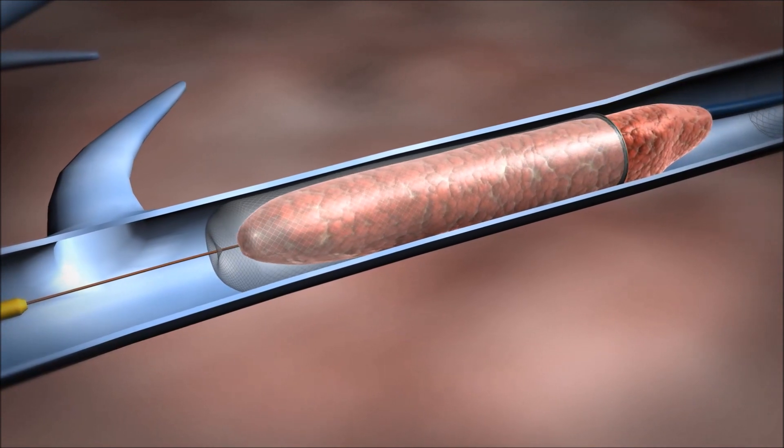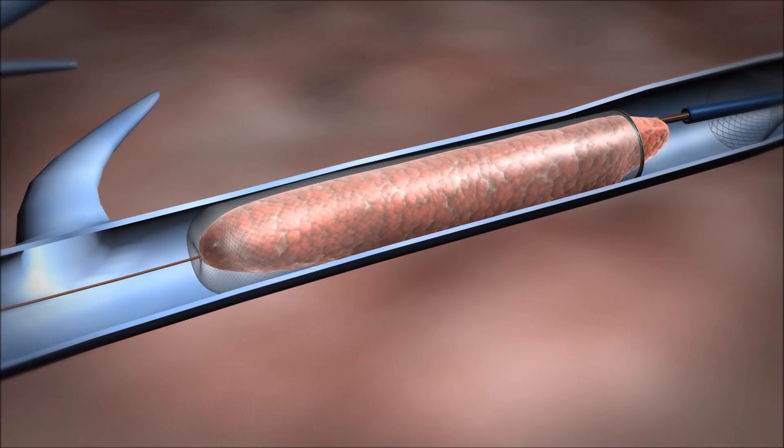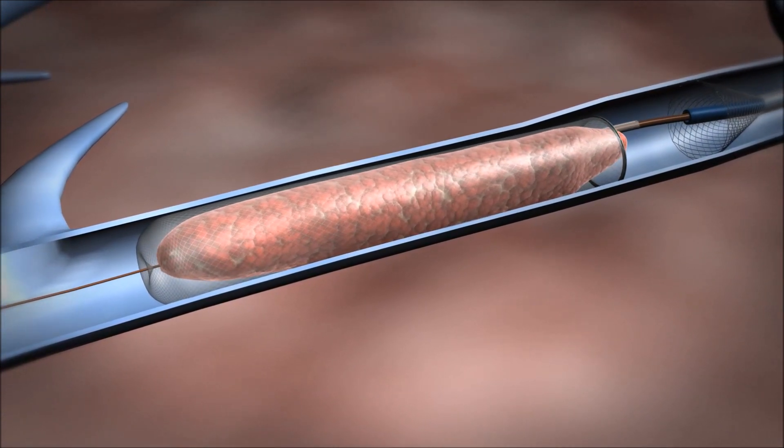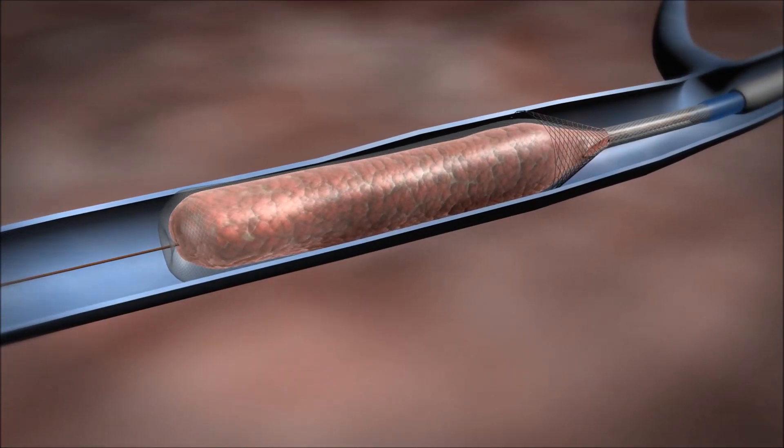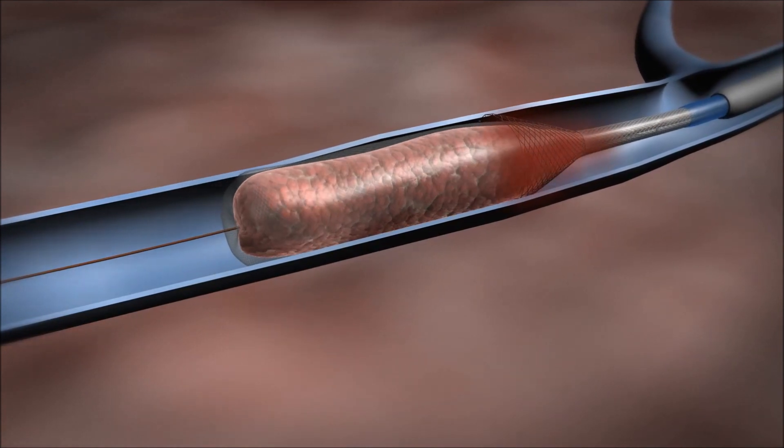As the delivery catheter is retracted, the self-expanding dynamic lengthening mechanism extends the basket to encapsulate and capture the clot in a smooth motion. Once the clot is contained inside the basket, it is retracted into the funnel catheter.